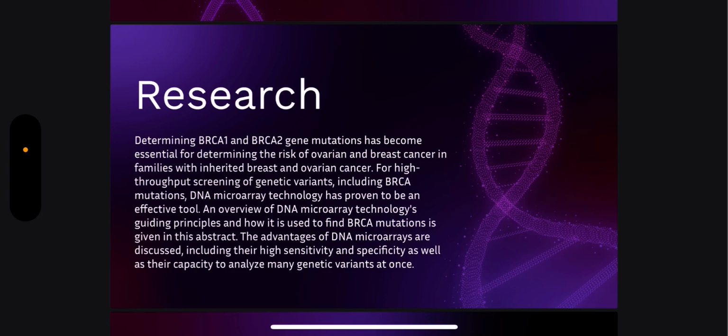An overview of DNA microarray technology's guiding principles and how it is used to find BRCA mutations is given in this abstract. Advantages of DNA microarrays are discussed, including their high sensitivity and specificity, as well as their capacity to analyze many genetic variants at once.